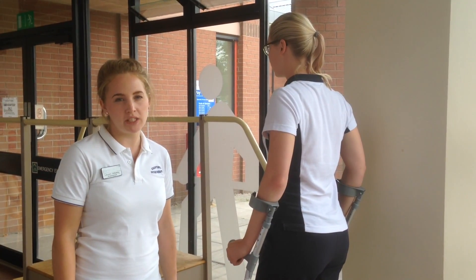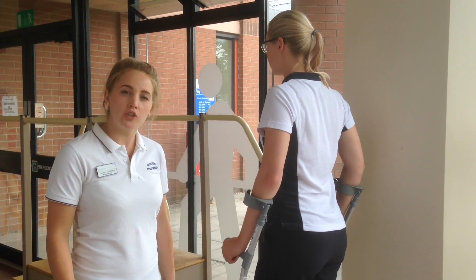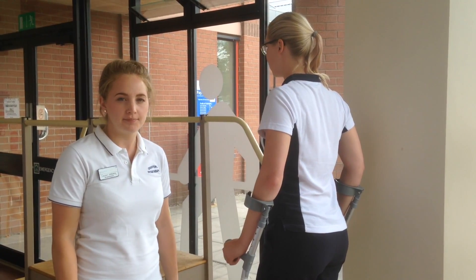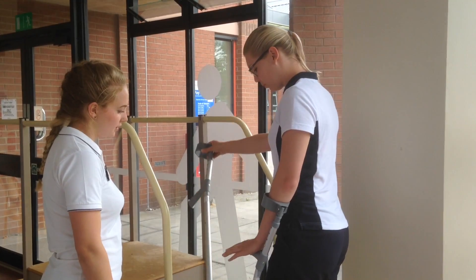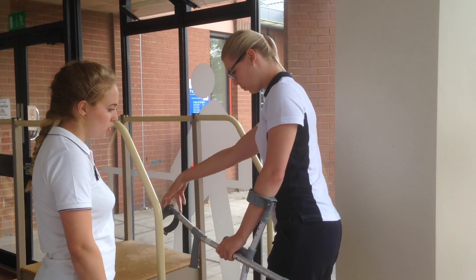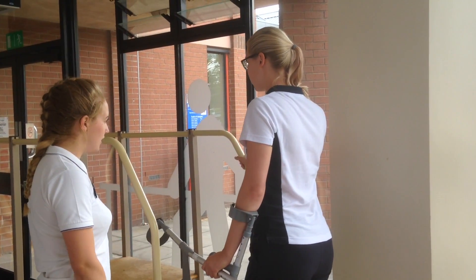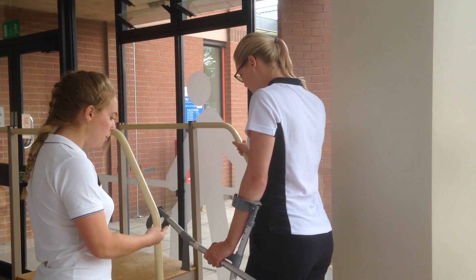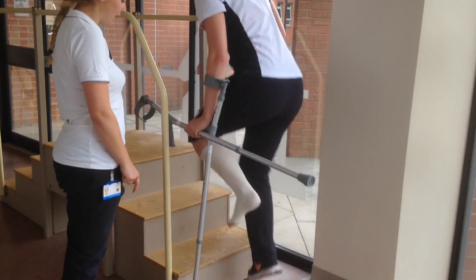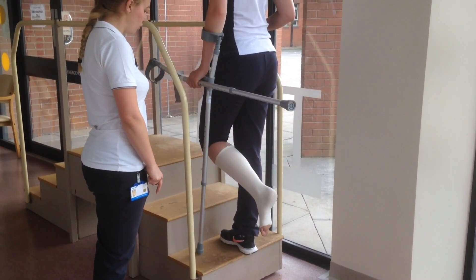Depending on which side your banister is at home, you will hold your crutch in the opposite hand. Hold your crutch in either of your hands so you have two crutches in one hand, and place the other hand on the banister. Putting your weight through your crutches, hop up onto the step with your good leg. Bring the crutch to meet it.